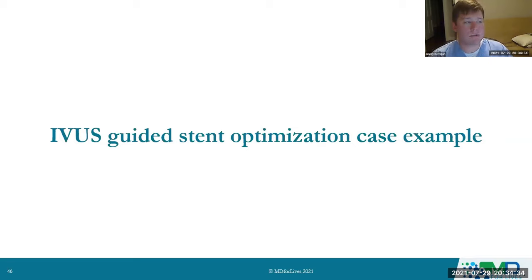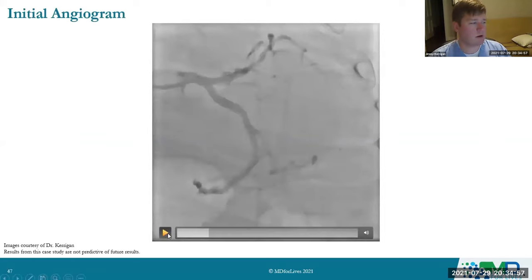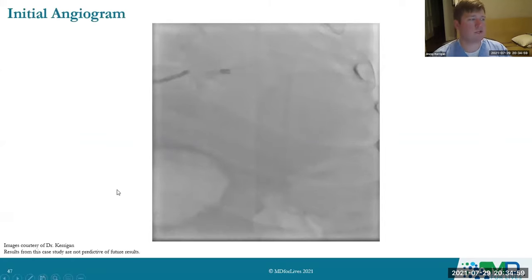It is a class 3 recommendation, so don't do it because it's harmful to put IVUS in somebody if there's not a question you're trying to answer. Don't just do it. With the exception being heart transplant patients, where we will perform intravascular imaging looking for coronary allograft vasculopathy where the walls start to thicken, and that sometimes requires a change in their immunosuppression at our institution.